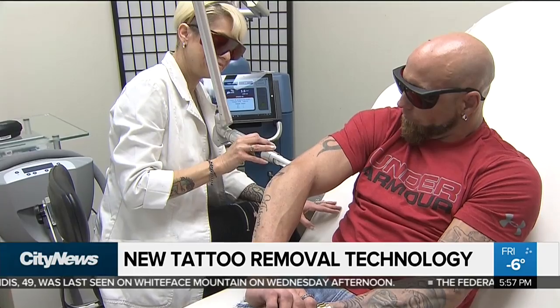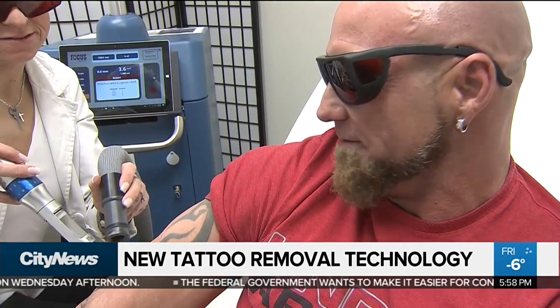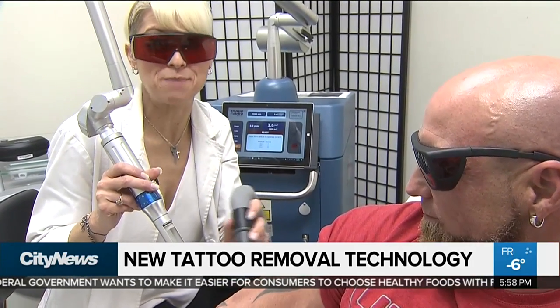How would you describe how it feels? It's very painful — like snapping pain? Yeah. Most of my patients describe it as an elastic band sensation, like if you had siblings and they used to snap elastic bands at you.